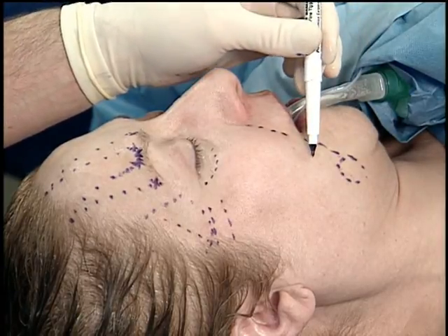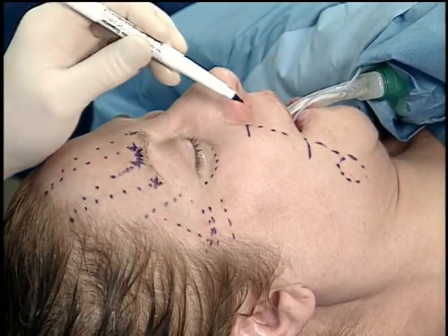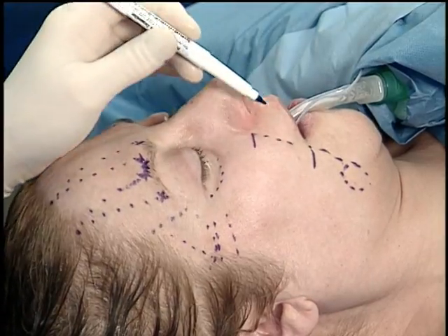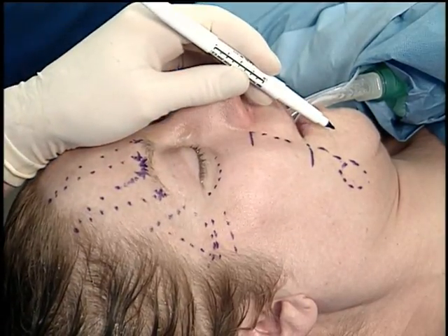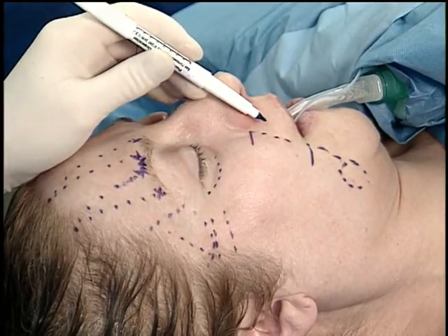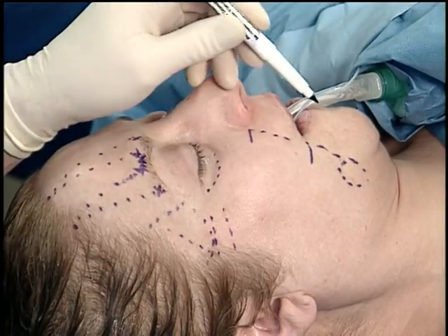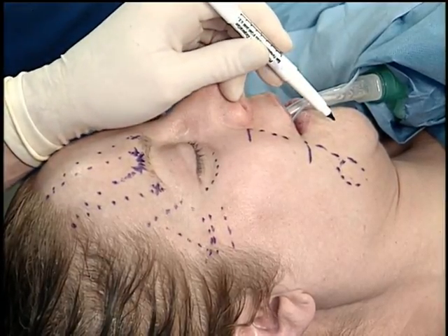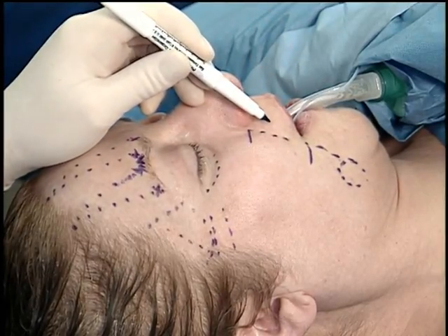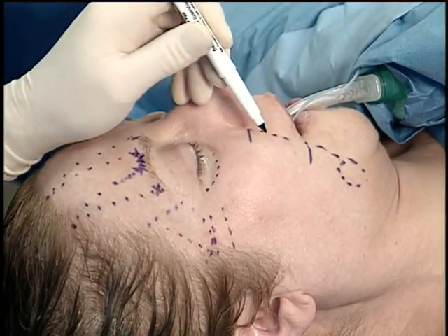and above. So I divide the face into commissure and alar base. I always exit about half an inch lateral to the nasolabial and labiomental fold. As you get medial, the 2 or 3 facial muscles subserved on the superficial surface, the levator labii superioris or the levator labii alaeque nasi muscle and depressor labii inferioris or the mentalis become vulnerable, as those fine terminal motor branches are vulnerable to the deployment needle of the contour articulus thread. So stay lateral to the nasolabial labiomental line, you should be safe.